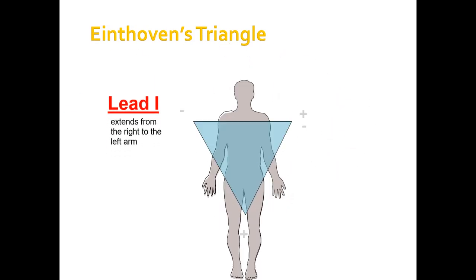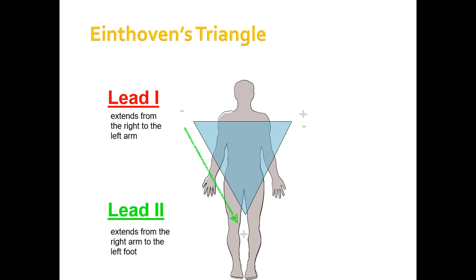This is Einthoven's triangle. जब पहली मरतबा आइंथोवन ने ECG डिस्कवर की थी, इजाद की थी, तो उसने जो लीड्स लगाई थी उनको देखते हुए आइंथोवन्स ट्रायंगल का कॉन्सेप्ट आया था. सो तीन लीड्स हैं बेसिकली जो पहली मरतबा लगाई गई थी.